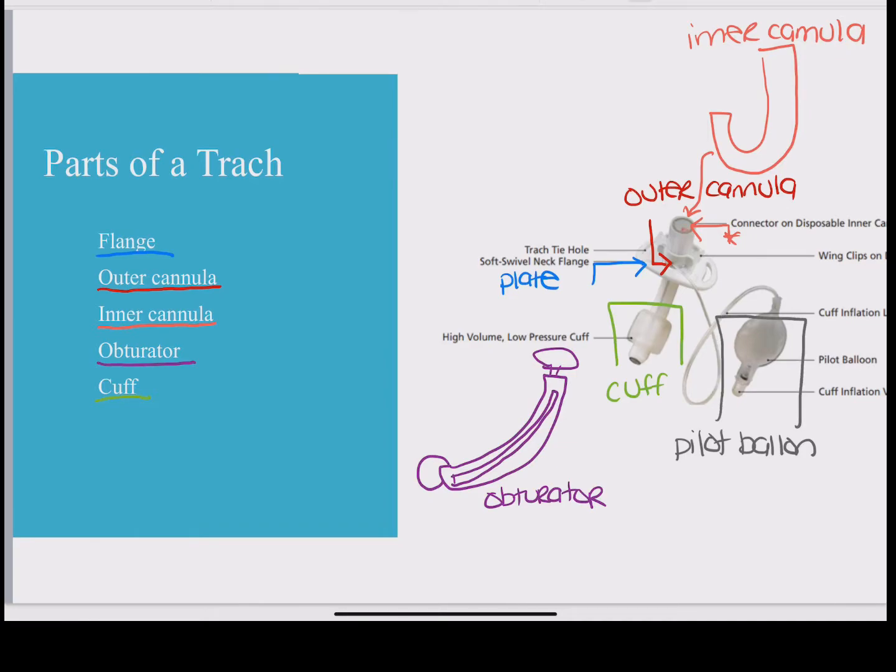For check-off purposes, we're going to use the shoelace neckties, which is going to be on the sides of your plate. At the hospital, we do have Velcro ties, but in our trach kits, they are the shoelaces. Just to make your guys' check-offs a little bit more challenging.